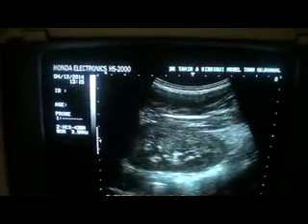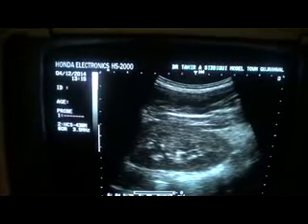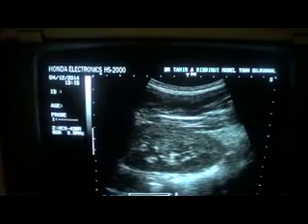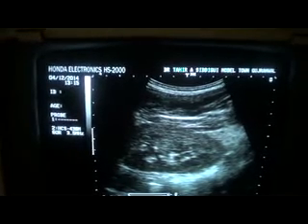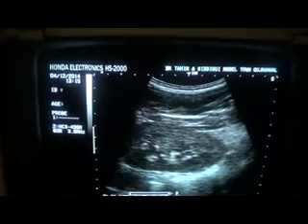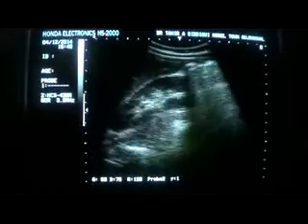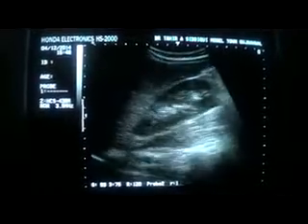So this is how we study the kidney, and in this case it can be a case of UTI, it can be a case of interstitial nephritis, it can be a case of glomerulonephritis as well. So further investigations are required to reach the cause. I will suffice with the sonographic findings in this case. Thank you very much. This is regarding the ultrasound study for comparison purpose with the pathological kidney with parenchymal changes that I showed you.